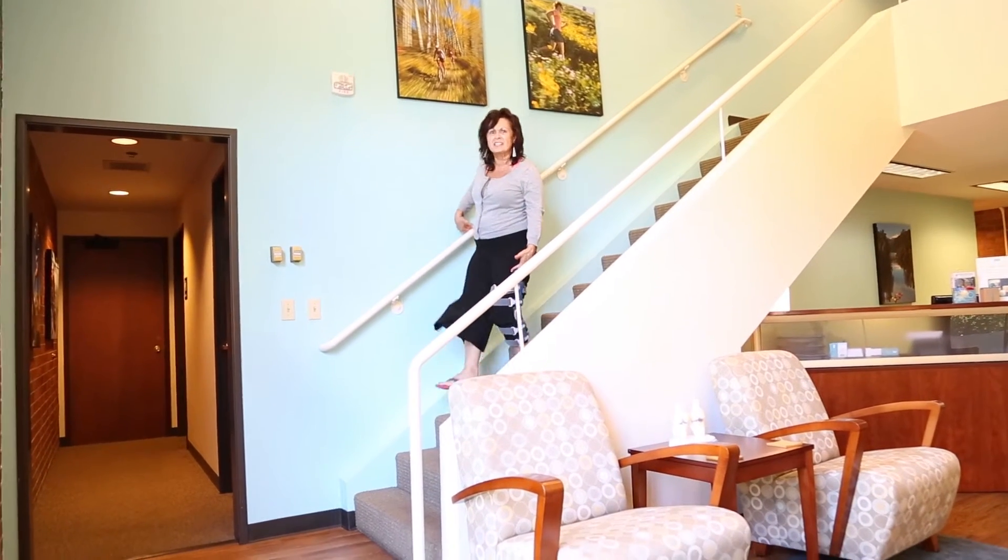The brace not only helps with alignment and correction of compensation patterns, it also promotes the correct use of the muscles that are the main knee stabilizers. It will decrease motions that contribute to chronic wear and tear of the joint, which will help extend the health and longevity of your knee.